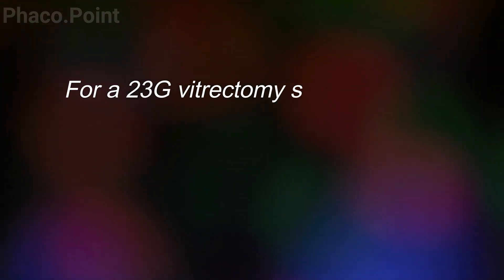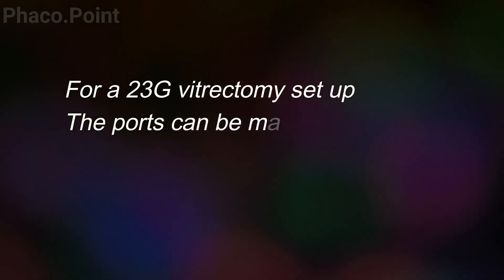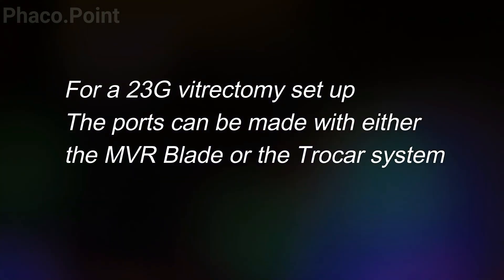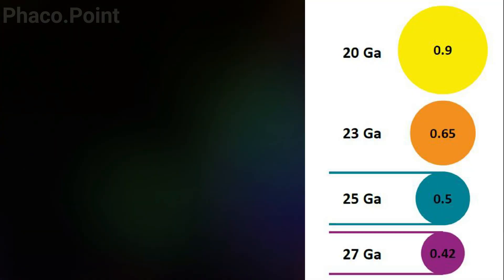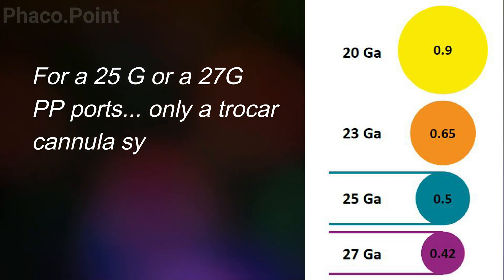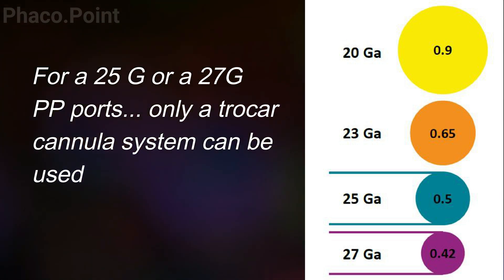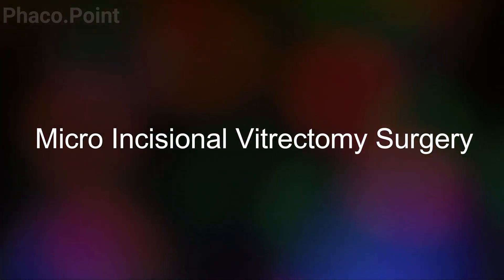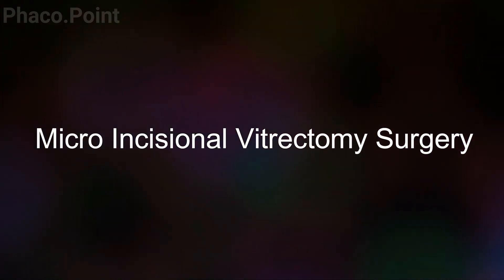The ports for a 23 gauge pars plana vitrectomy are created with either a 23 gauge MVR blade or a trocar cannula system. As you go smaller — that is with 25 or 27 gauge — the ports are exclusively made with the trocar cannula system. The 23, 25, and 27 gauge ports are self-sealing and do not require suturing. Vitrectomy using 23 gauge and smaller constitutes micro-incisional vitrectomy surgery.